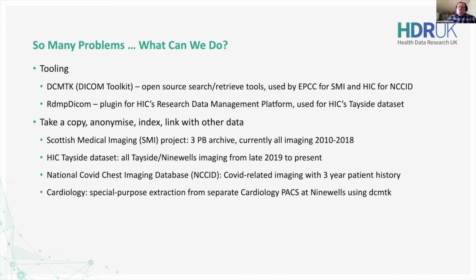That's involved a lot of organizational work to get appropriate approvals in place, and then also technical work to gather all of that data together and link it in a usable form, while also anonymizing it and guarding against identifiable data creeping in. We saw 4 of the, what should have been 4 of the chest x-rays in it earlier.